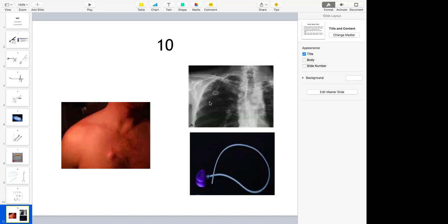There is the chemoport chamber and a catheter along with the lock that connects the two. Which veins are used for putting in a chemoport commonly? Internal jugular vein. Right IJV is the commonest site, because it has a straight course. Or even in the subclavian vein.